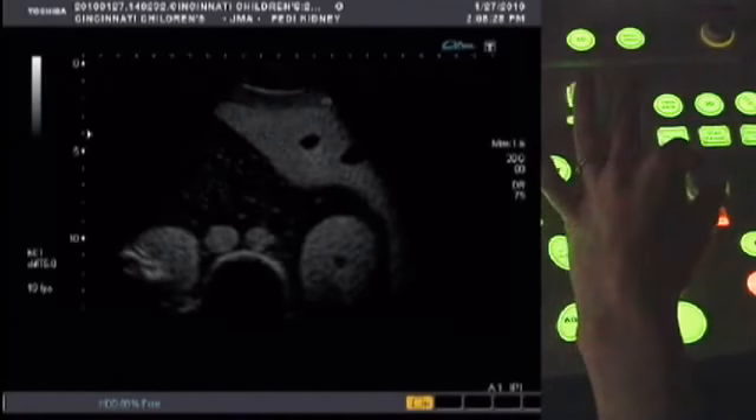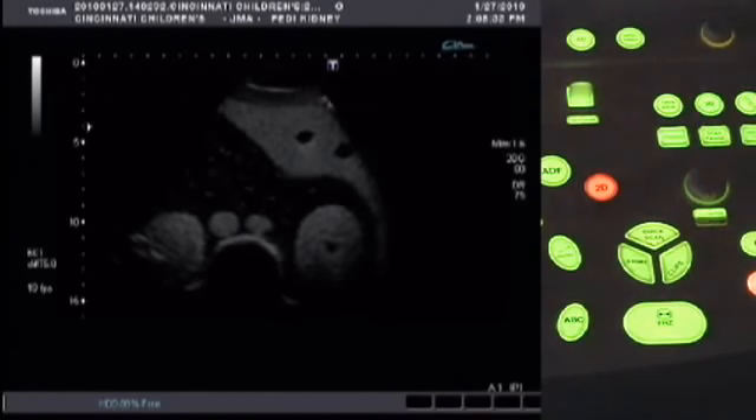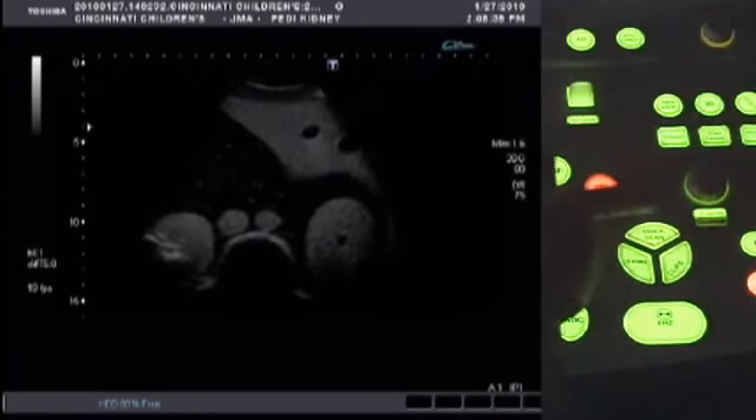We'll zoom in just a little bit. Pressing Q-Scan will autofocus the image — press that button.